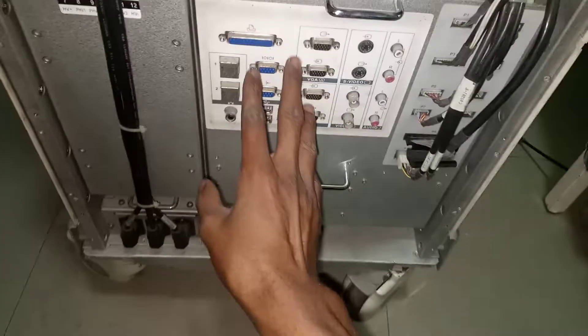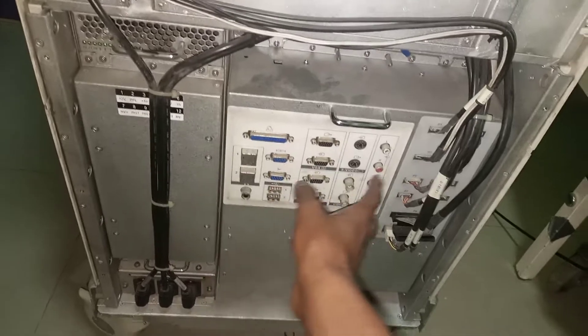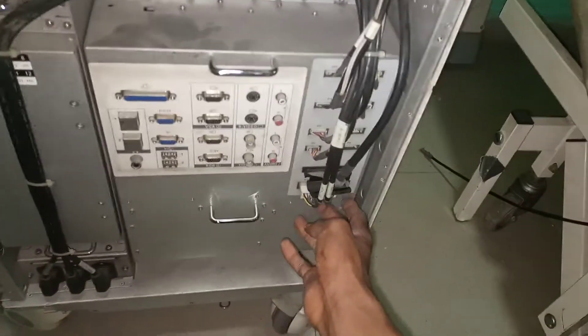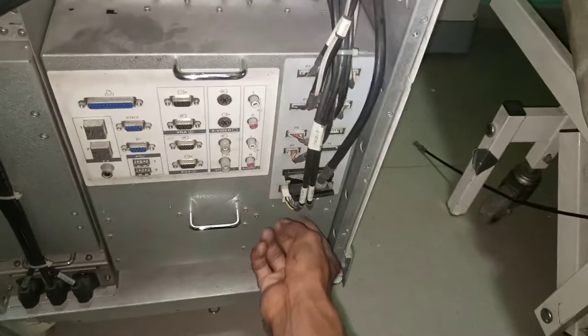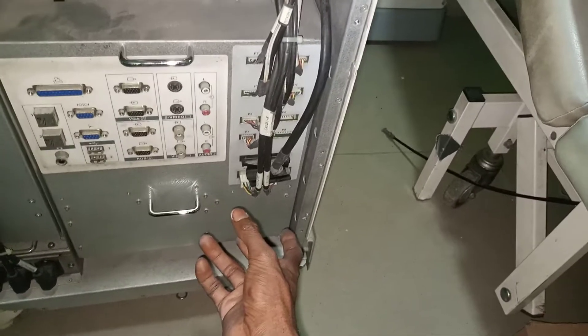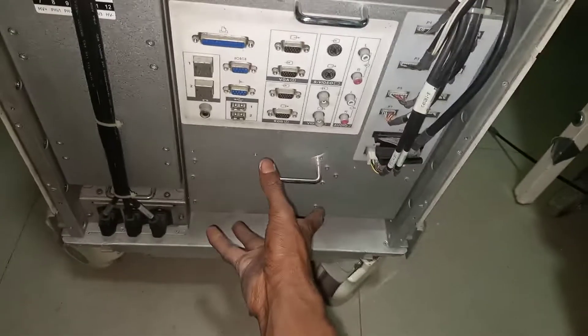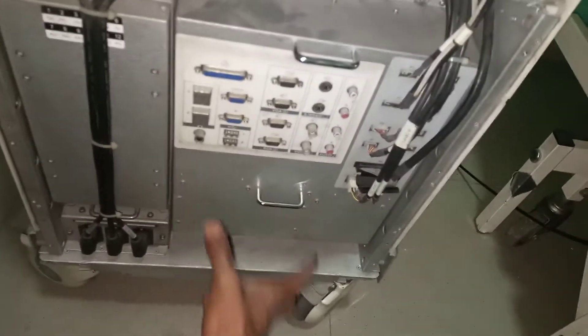These are the ports to connect your cables and wires, and these are the various cables going into the machine. During treatment and maintenance, you need to be able to remove and fix all of them back.